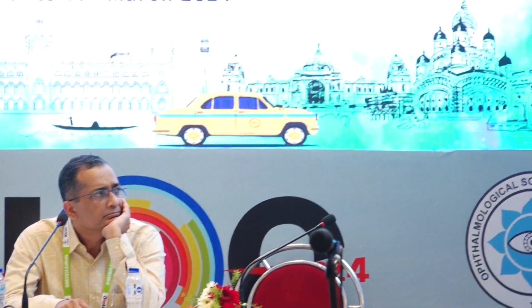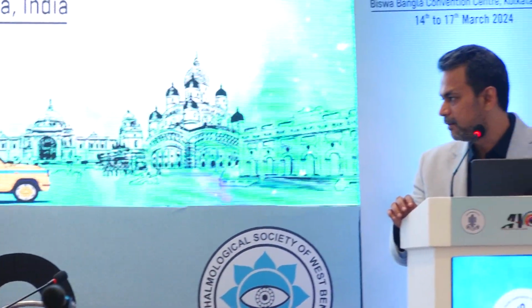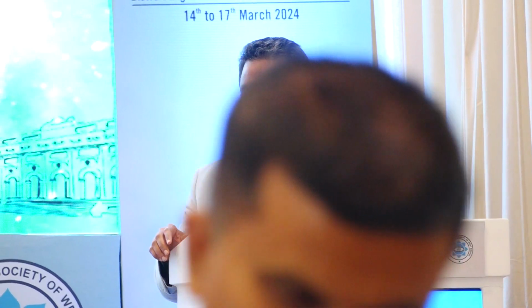Yeah, because here, when you have to rule out a choroiditis versus fibrinous exudation in CSR, in one condition steroid is the treatment, in the other condition steroid is contraindicated. So it's extremely important to do multimodal imaging in the kind of cases which I have shown initially, misdiagnosed to be a fibrinous variant of CSC and then turned out to be Harada's disease, or vice versa.